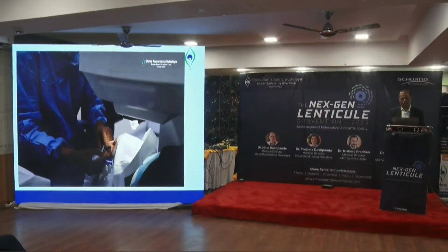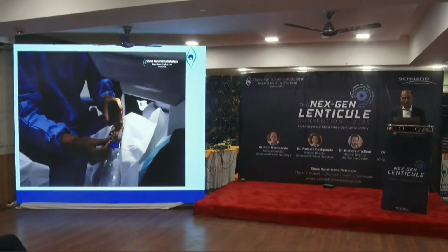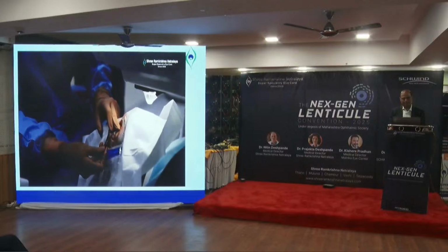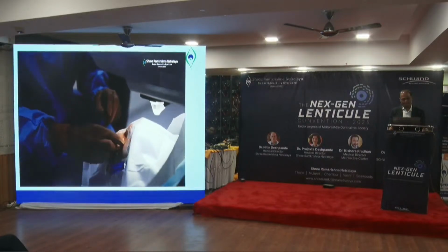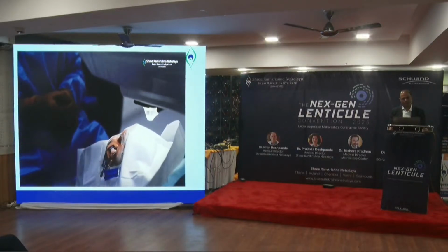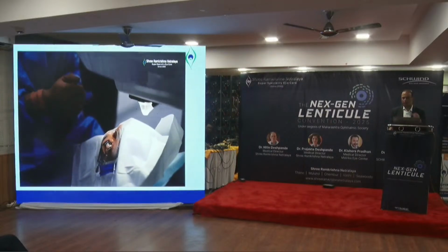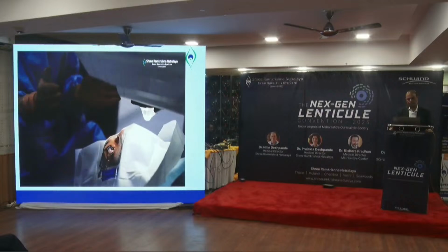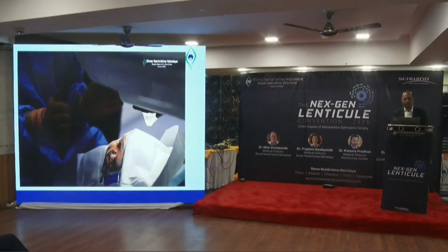It's a very small instrument to keep your eye open, Bharat. Yeah, looks good. It is very important that when I tell you not to move and that the procedure has started, it's very important that you don't move your eye, okay? Okay, sir. So just relax and keep looking the way you are looking.